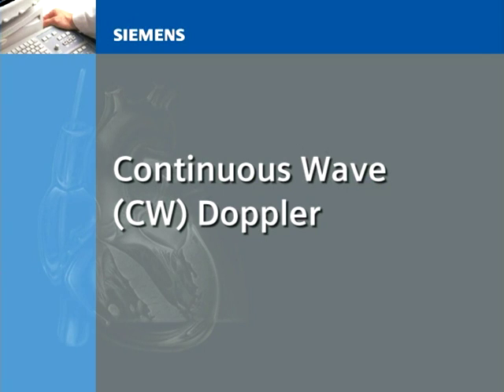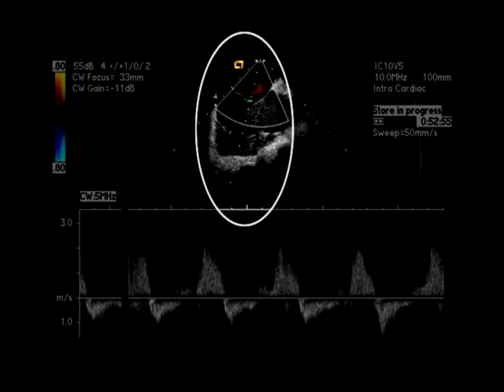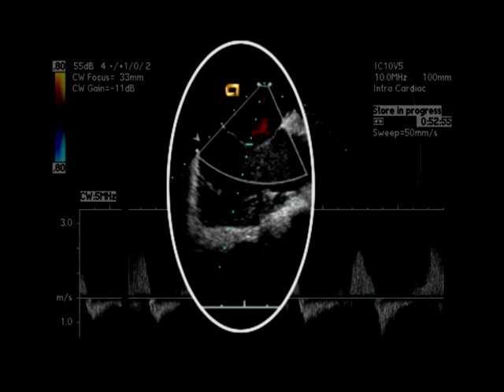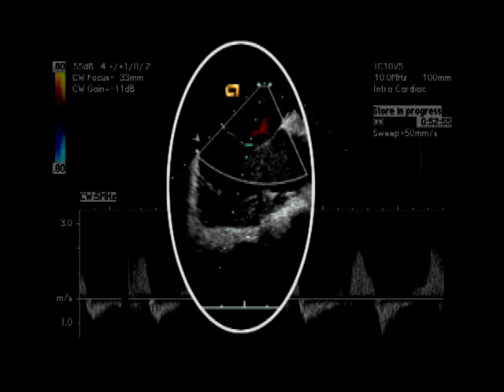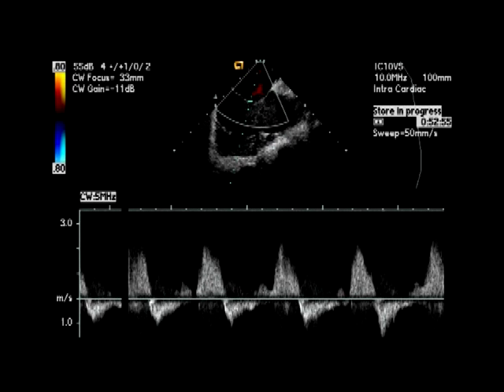Continuous Wave (CW) Doppler. This example of CW Doppler allows for the calculation of peak velocity. CW Doppler does not have the aliasing limitation of PW Doppler and can be used to characterize very high velocity blood flow. CW Doppler can determine the maximum or peak velocity through a specific valve or chamber within the heart. However, because it does not utilize a sample gate as in PW Doppler, it is incapable of determining the exact location of very high velocities.